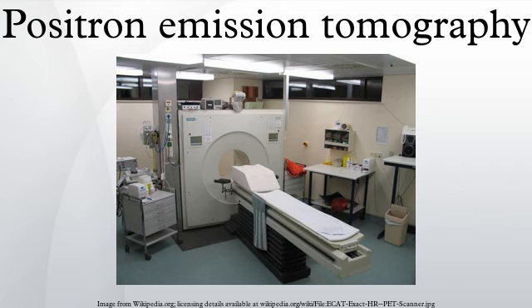These amyloid imaging probes permit the visualization of amyloid plaques in the brains of Alzheimer's patients and could assist clinicians in making a positive clinical diagnosis of AD pre-mortem and aid in the development of novel anti-amyloid therapies. 11C PMP is a novel radiopharmaceutical used in PET imaging to determine the activity of the acetylcholinergic neurotransmitter system by acting as a substrate for acetylcholinesterase.